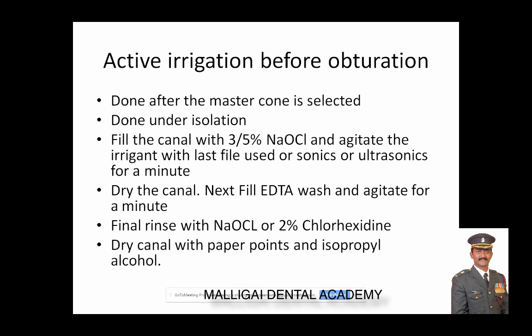What does this do? The agitation of the sodium hypochlorite within the canal system flushes out any remnants of organic and inorganic debris which are left behind in the canal system or the lateral canal system, the lateral exits. Liquid EDTA brings this debris into solution. It softens the dentinal wall and removes the smear layer created by rotary instrumentation, thereby giving us a clean root canal wall surface for the sealer to flow against.